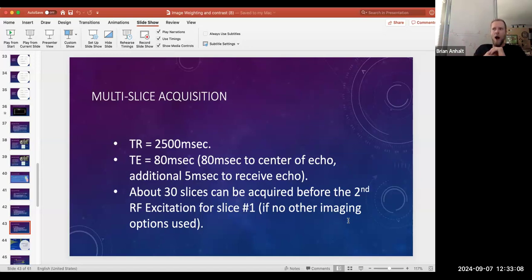I just want to bring in this principle in MRI, and a lot of techs really don't get this down. They wonder why their scan times are adjusting when they're adding or subtracting slices, why their TR has increased too much, and what they can do to adjust it if they need a lower TR to get T1 contrast.